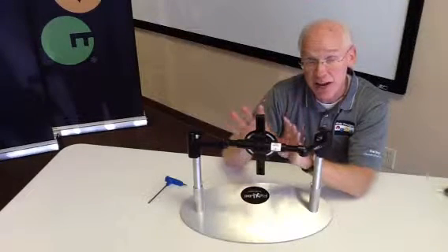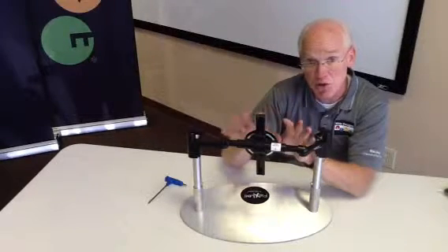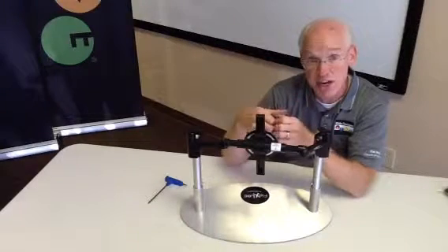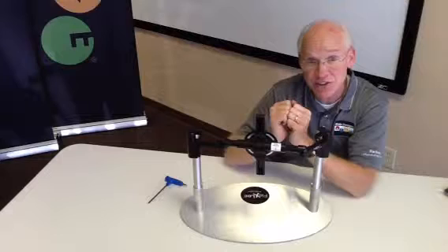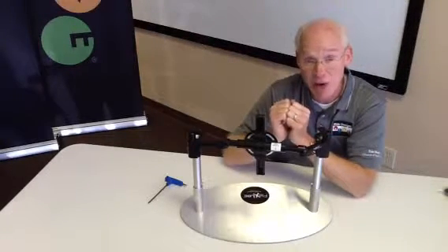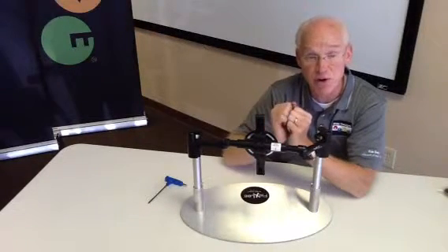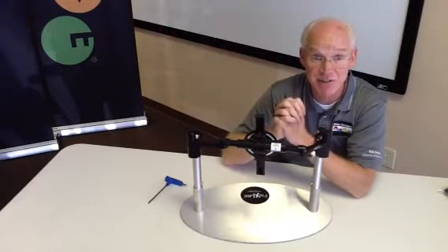That is how you adjust the flex lock hardware with the Ride Custom Back for optimal orientation. Get it eyeballed in and set up, then go out and do your fitting. When you get to your client, simply loosen those axes, adjust the back to fine-tune the orientation, and tighten it down. Double-check all of your fasteners at the end of your fitting to make sure everything is as tight as possible. This back hardware will stay in place, stay in adjustment, and provide a really robust interface for your client. Thank you very much.